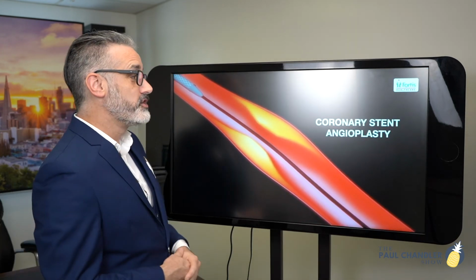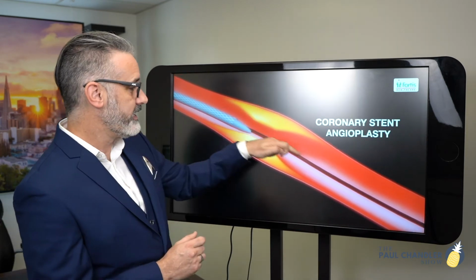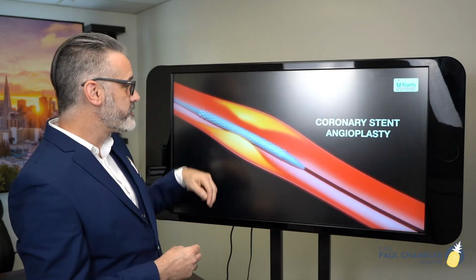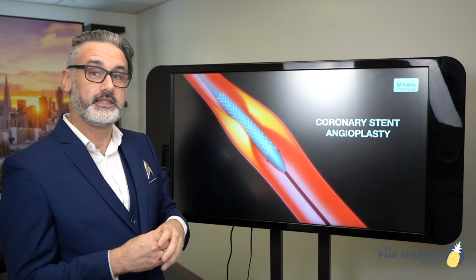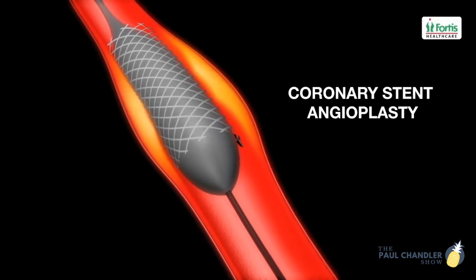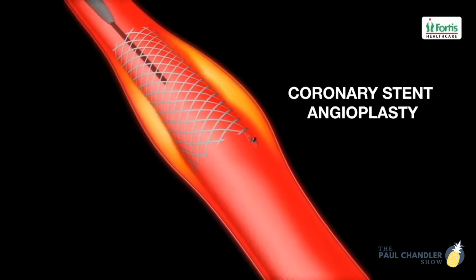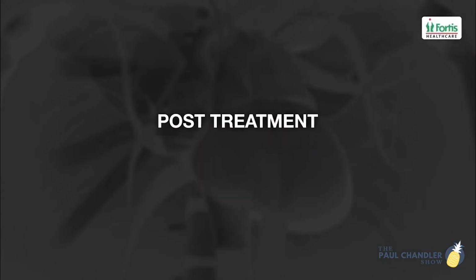Now in this case, the doctor's going to do a coronary stent angioplasty. Same concept, where you have the guiding tube in, and then the catheter goes in, but instead, wrapped around the catheter is this wire mesh. So when the doctor gets the mesh into place between the blockage or the plaque, the doctor expands the balloon, and the mesh stays secured once it's open, leaving a permanent tunnel for the blood vessel to have enough blood to go through.